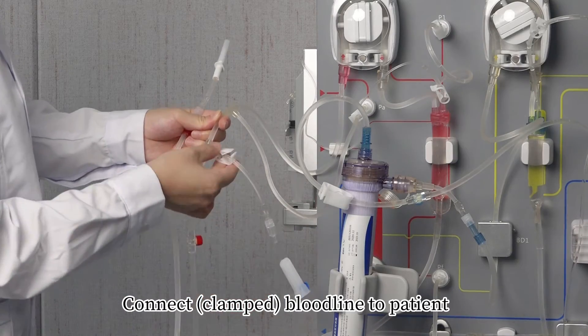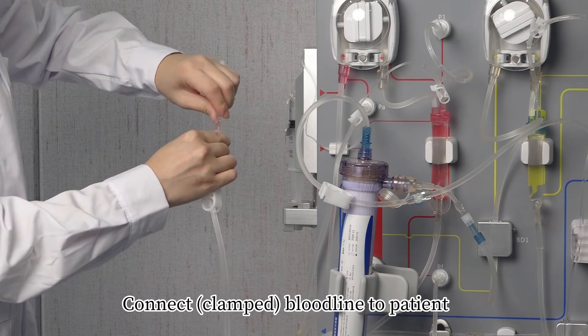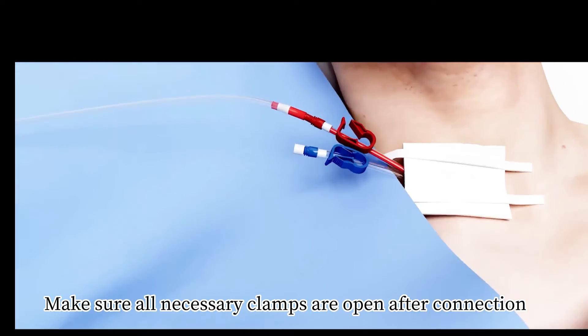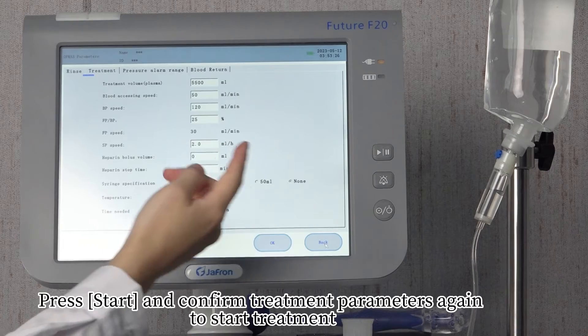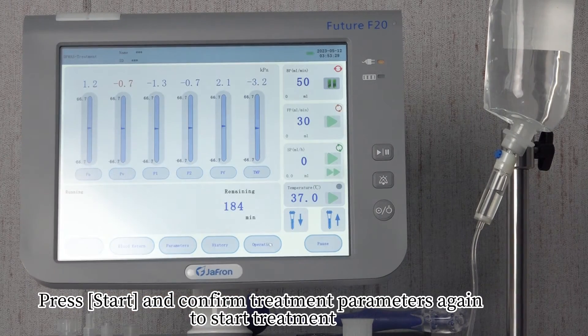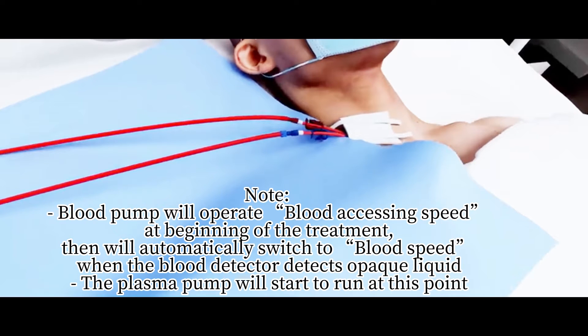Connect the bloodline to the patient. Make sure all necessary clamps are open. Press 'Start' and confirm treatment parameters again to begin treatment. Note: The blood pump will operate at blood access speed at the beginning of treatment, then will automatically switch to treatment blood speed when the blood detector detects opaque liquid. The plasma pump will start to run at this point.